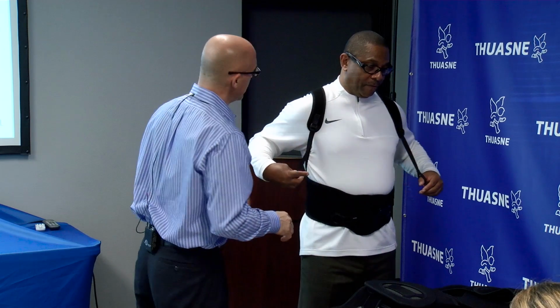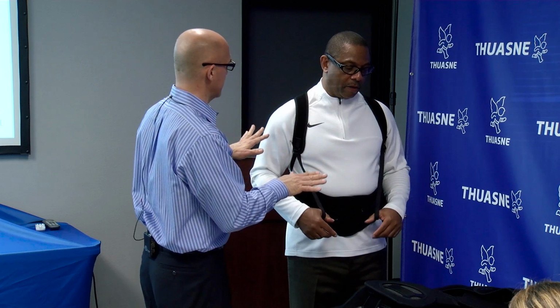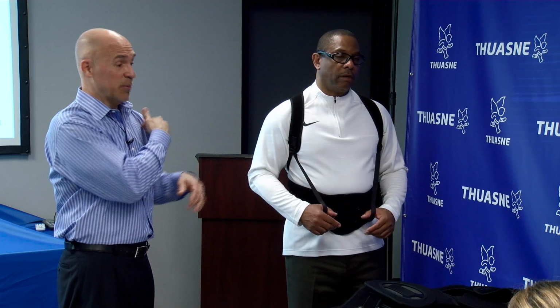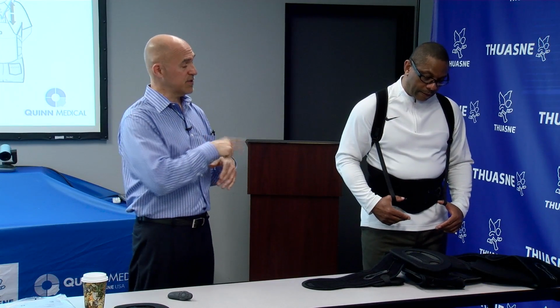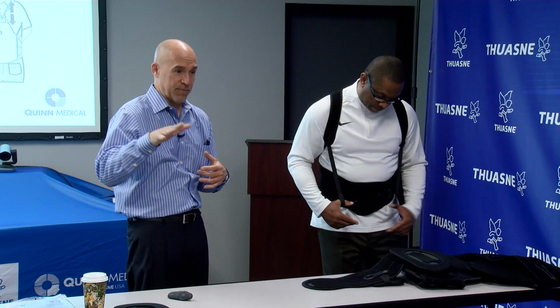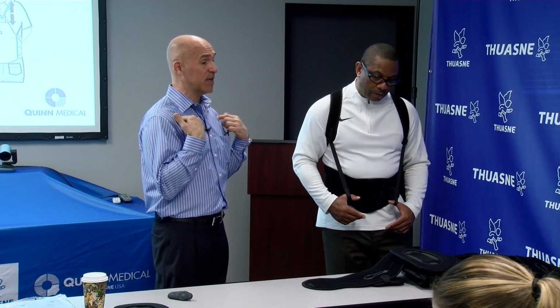So now shoulders back, I don't want you to make it tight. I want you to just make it slightly snug. Done. Okay. So now the idea is all we want out of this is a little bit of pressure on the front of the shoulders, and that reminds the patient to use their own muscles to stand up. And there's a study on a similar device that showed increased strength in your spinal extensors, and I'll pull up the numbers in a few minutes. And also that postural angle, or kyphotic angle, improved because the patient got stronger. So pretty amazing that little reminder, kinesthetic reminder, is going to do that.